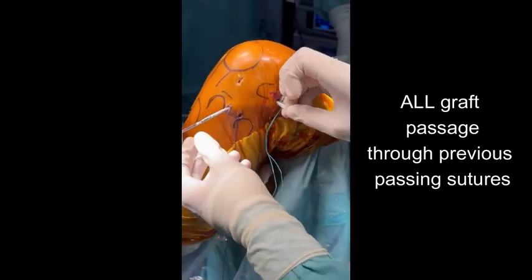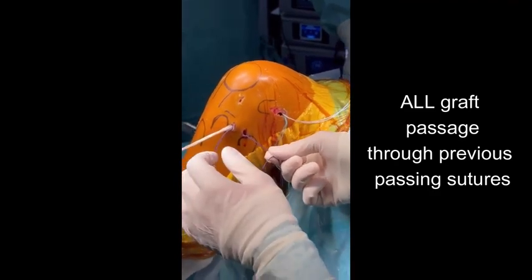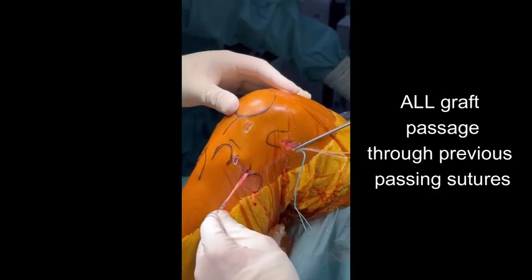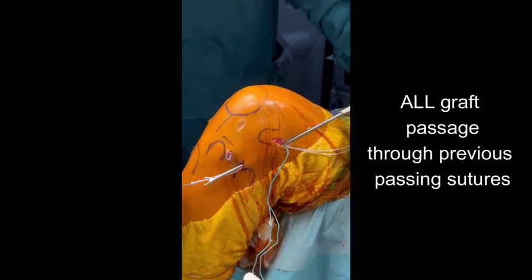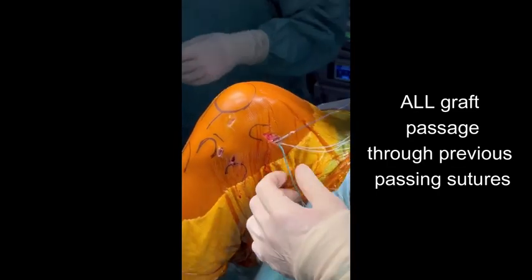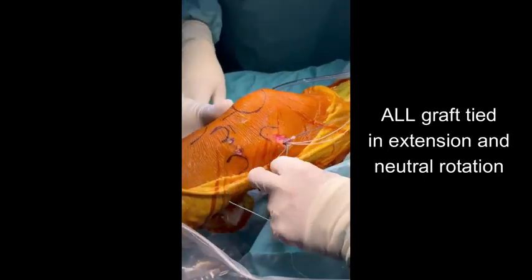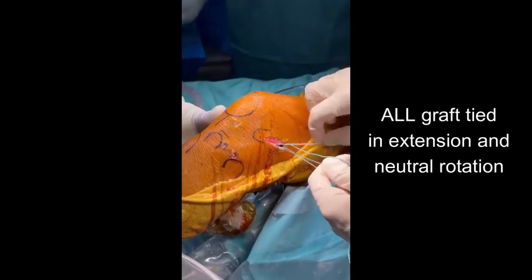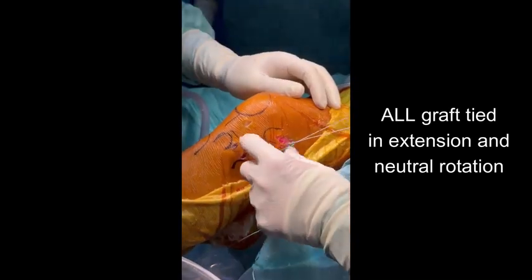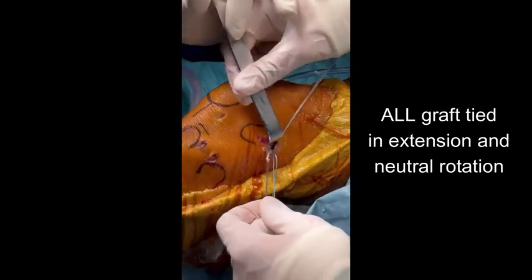The remaining gracilis is used for ALL reconstruction. Using an arthroscopic grasper, the sutures of the gracilis are passed over the previous passing sutures. At the proximal end, the sutures securing the ACL graft and the femoral button are encircled around the ALL graft and tied in full extension and neutral rotation.